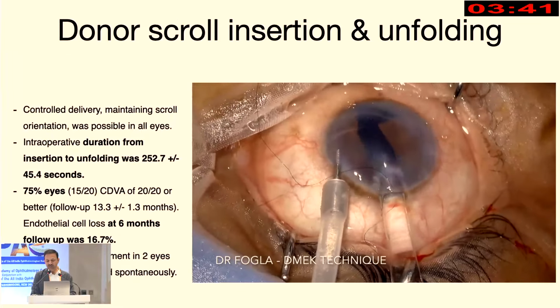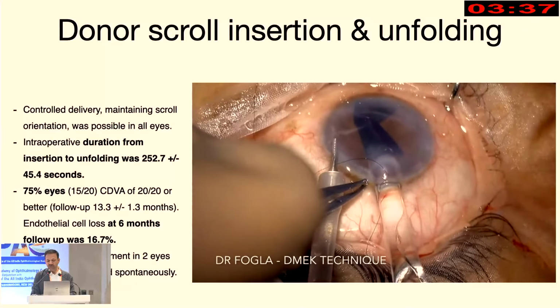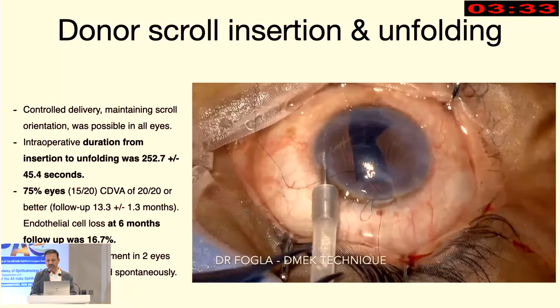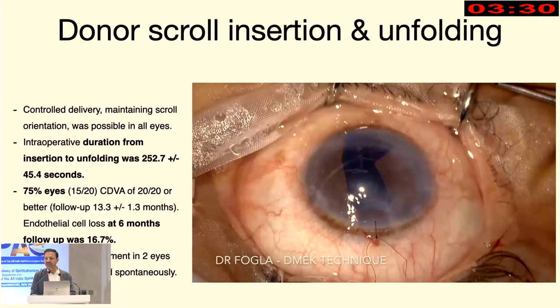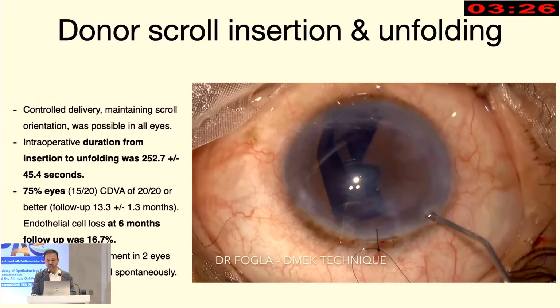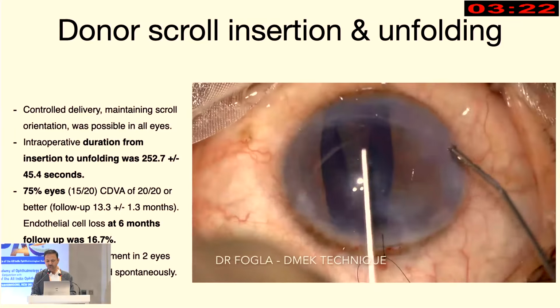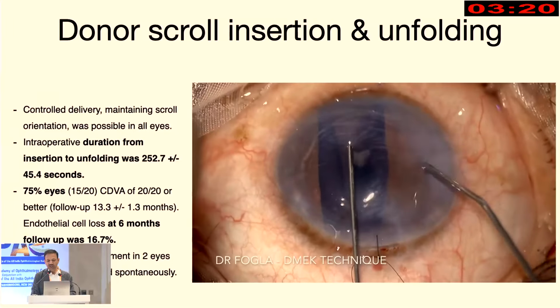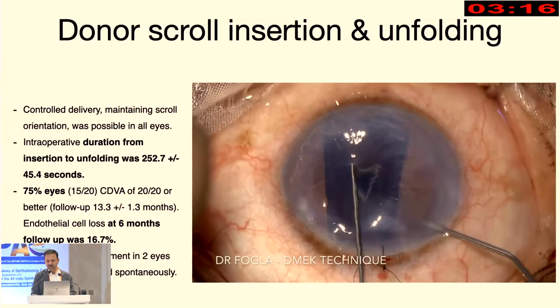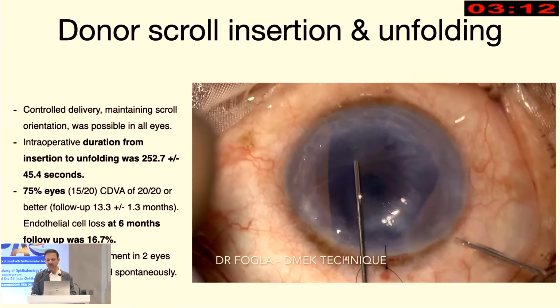You can see the scroll goes in very easily, and I'm removing the tip of the cartridge from the eye, and you can see that the cornea is dimpling down. There is no tendency for the scroll to open up. We put in a suture and slightly form the chamber because the chamber is shallow. It's a double scroll, and you can see I'm just holding it in the center, and if I tap on either side, I release some fluid. You can see the scroll opens up. Tap outside. This is already open.